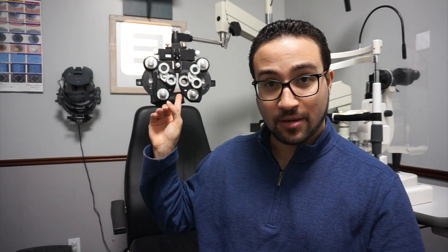Hello everyone, eye doctor Mike here. This video today is going to explain this machine right behind me — what do we call it, why do we use it, and how it helps us get a glasses prescription.